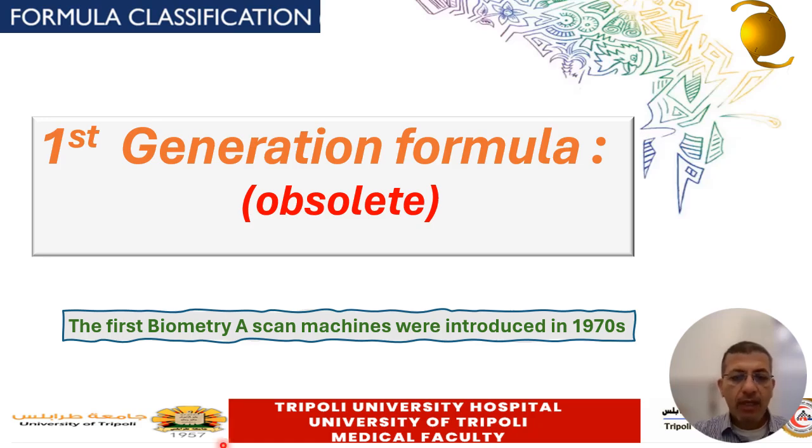Another point that I would like to emphasize is that IOL implantation predates the occurrence of A-scan ultrasound. The first IOL implantation was made by Dr. Ridley in 1949. However, the first ultrasound machine was invented in the 1970s. So IOL implantation started before the occurrence of A-scan ultrasound.